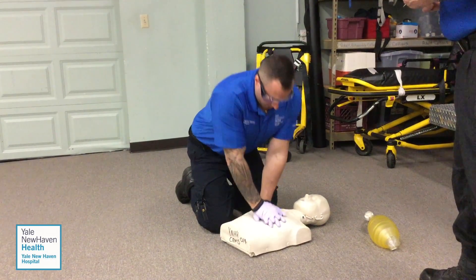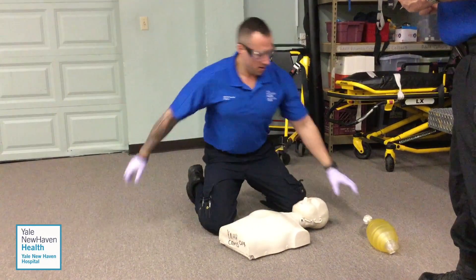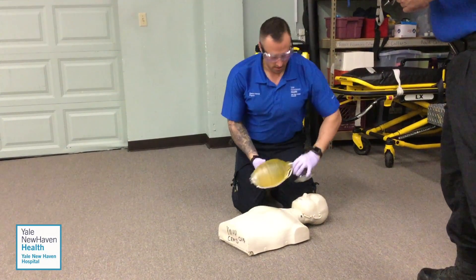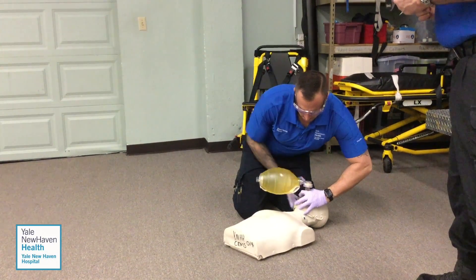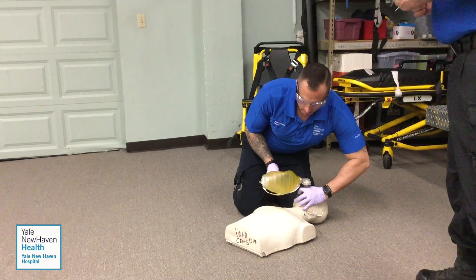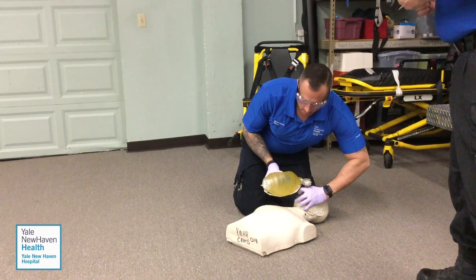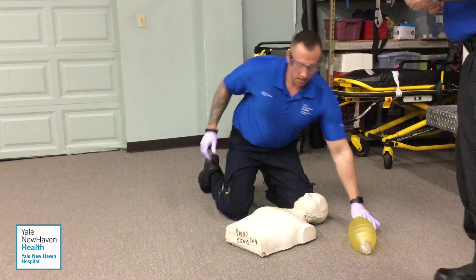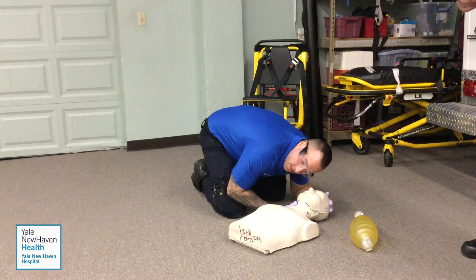5, 6, 7, 28, 29, 30 — and reassess the patient for pulse and breathing within 10 seconds.